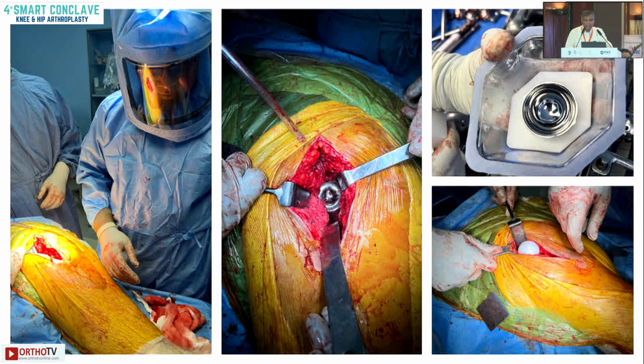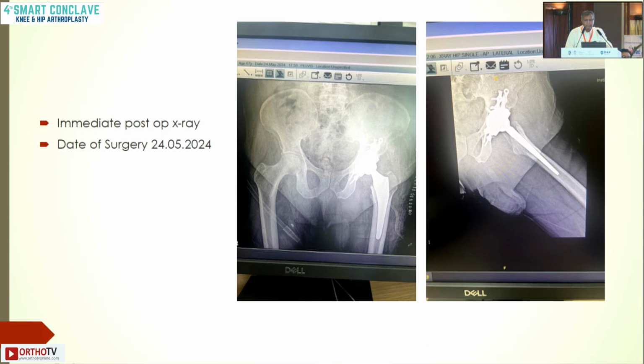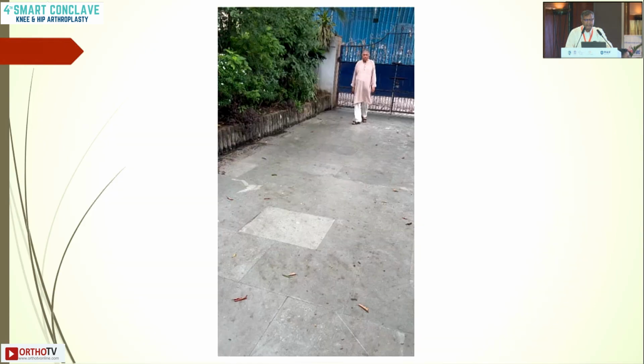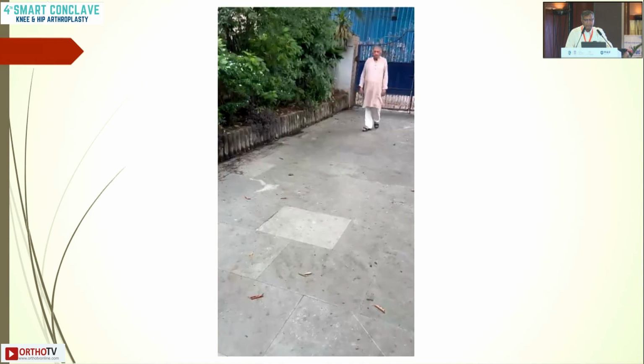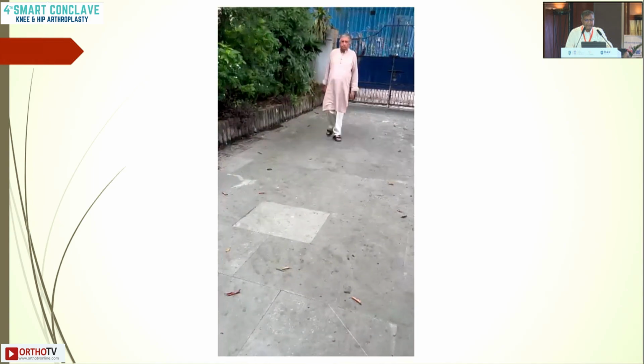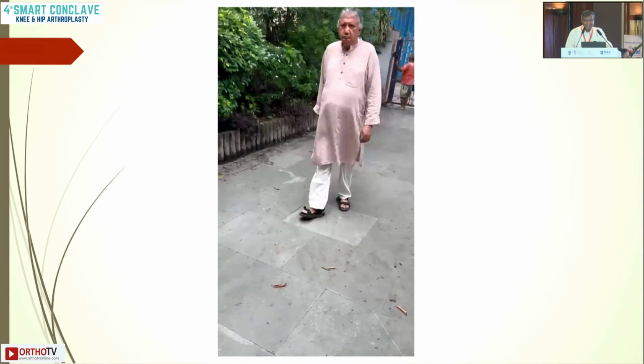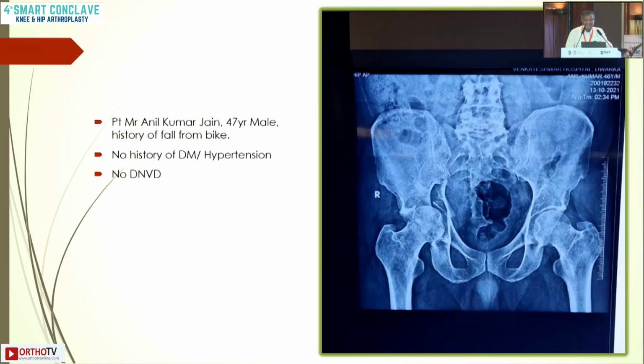So I planned an MDM dual mobility cup in this case, and this is the 3-month post-operative X-ray. Fortunately, it was 8 months, so the sciatic nerve has recovered on the left side. You can very well appreciate here, which was not in my hand. I was fortunate enough to get it.